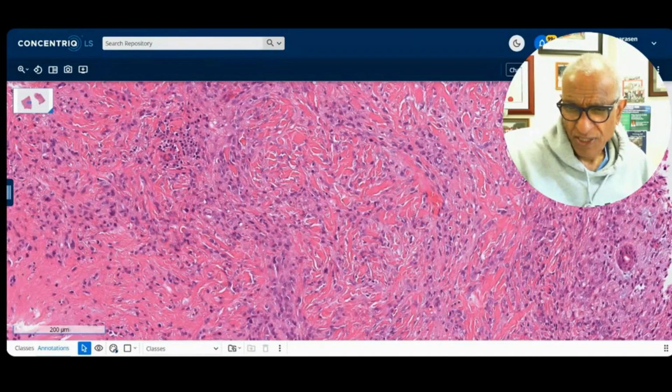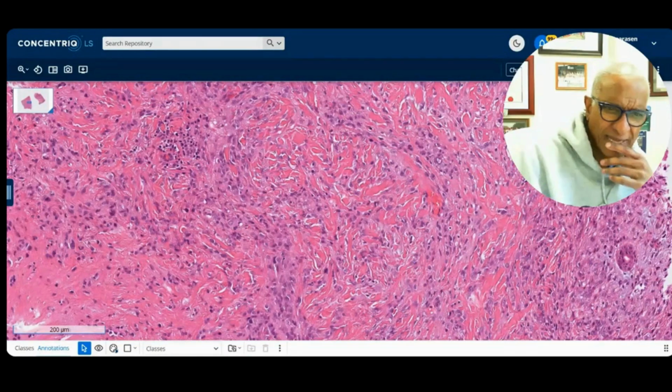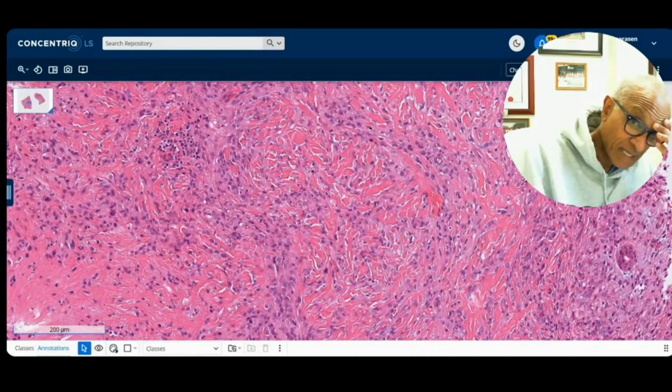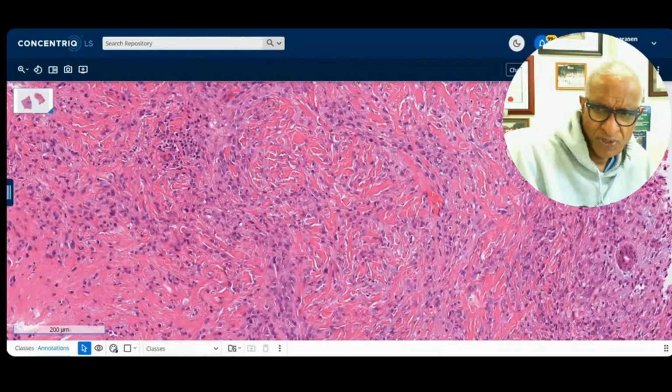Collagen, yes, the collagen. There is an old name that people used to use for this. It was sort of sclerosing as well. So you can get the sclerosis in it, and that has been described, this hyalinizing sclerosis in epithelioid sarcoma. It does throw you, but again, just working through your immunohistochemistry, you'd come to this conclusion, I'm sure. Okay.